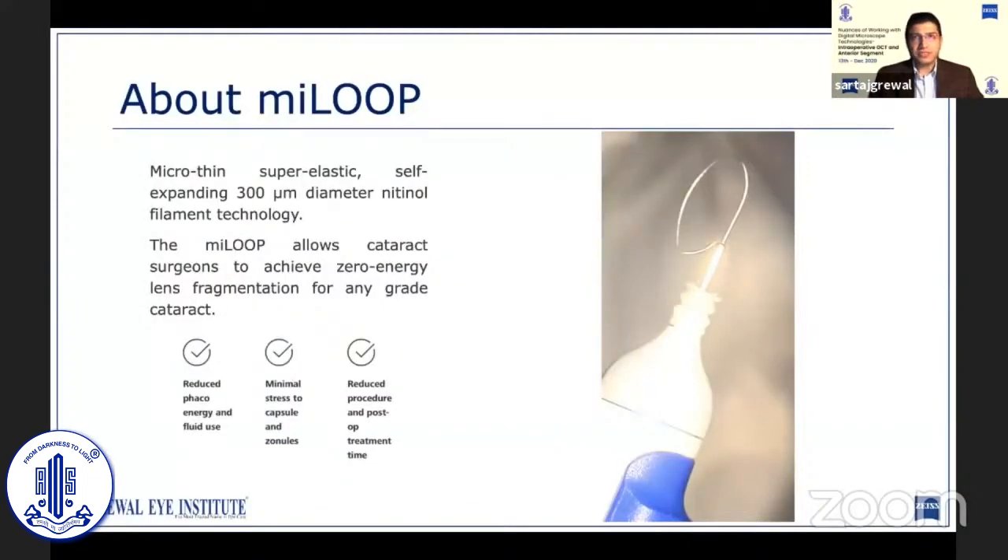The MyLoop features a retractable, micro-thin, super-elastic, self-expanding nitinol filament, which has a 300 micron diameter. Fully expanded, it has a horizontal diameter of 10.5 mm and an anterior-posterior height of 5.5 mm, which is more than enough to engulf even the largest nuclei. Once fully retracted, the loop has a diameter of 1.5 mm and can be easily inserted through a 2.2 mm incision.